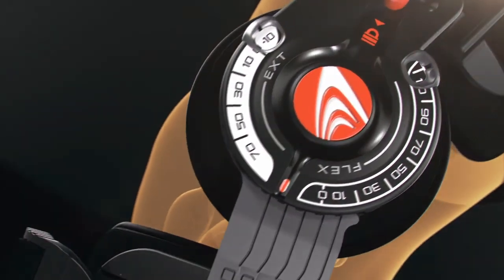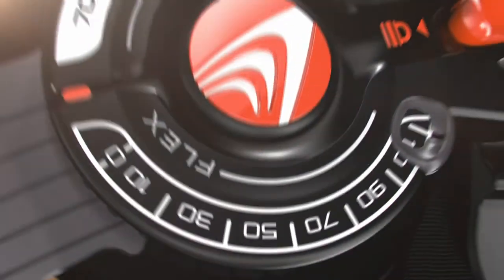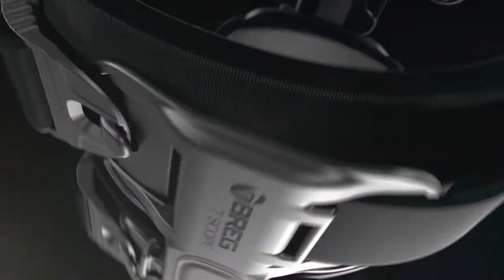The T-Scope Premier features several key upgrades over the original T-Scope: a refined range of motion hinge, enhanced user interface, the Bridgetek incision pad, and redesigned pads and cuffs.